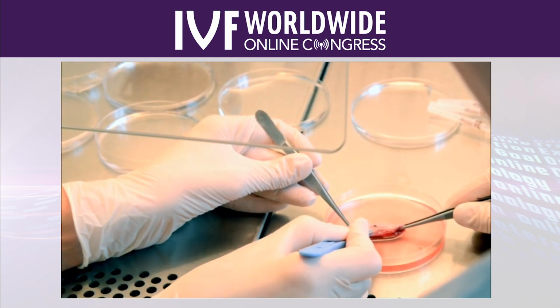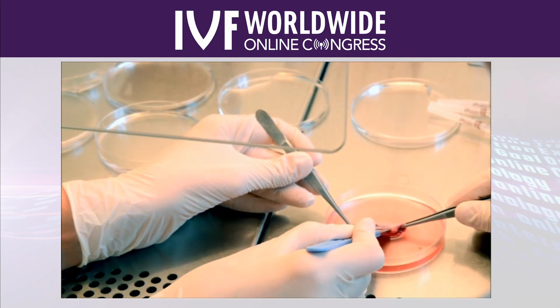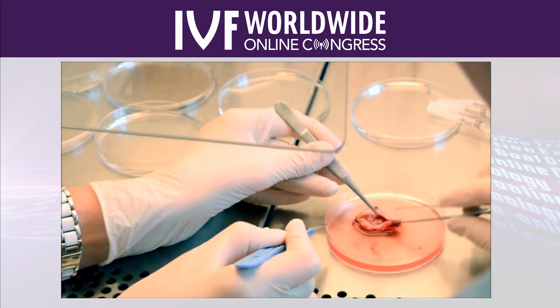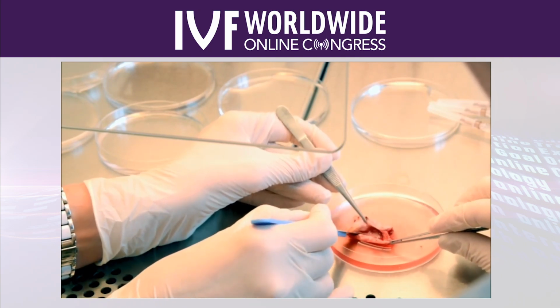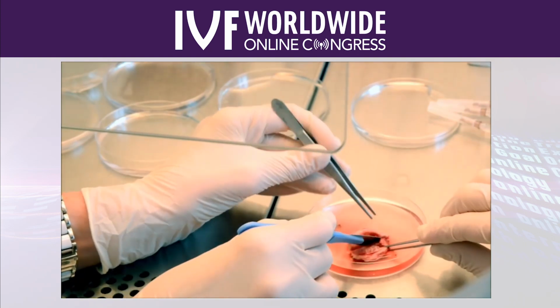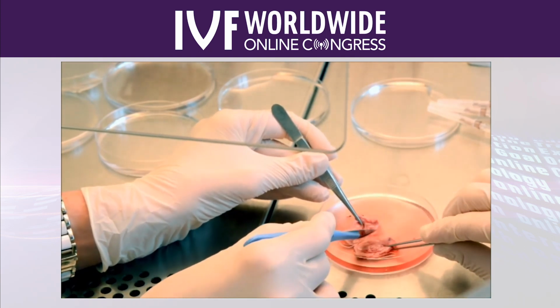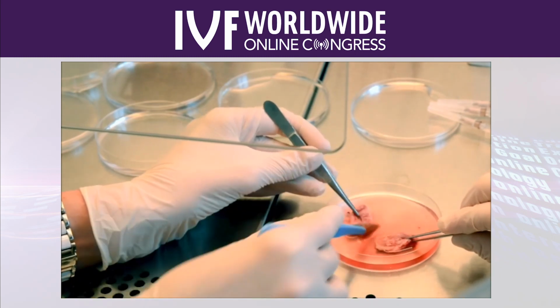So here you can see how we are cutting the ovary into 2 halves, and this is an important piece, because if you do the halvening in 2 equal parts, then it's a little bit easier to prepare the ovary. And as you can see here, it's very nice to have 3 hands. So this is one reason why we are always 2 people to perform this procedure. One thing is, of course, the speed. We can do this faster if we're 2 people, but also to do the halvening of the ovary, it's a lot easier when you're 2 people.